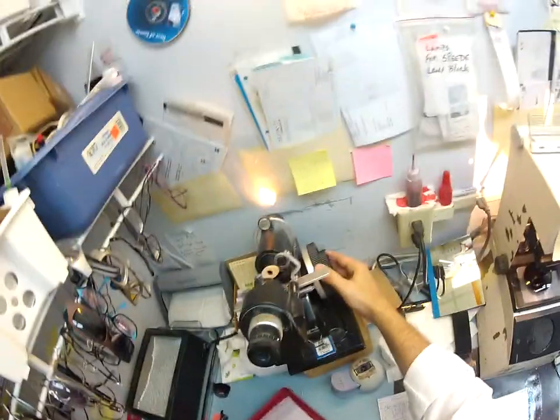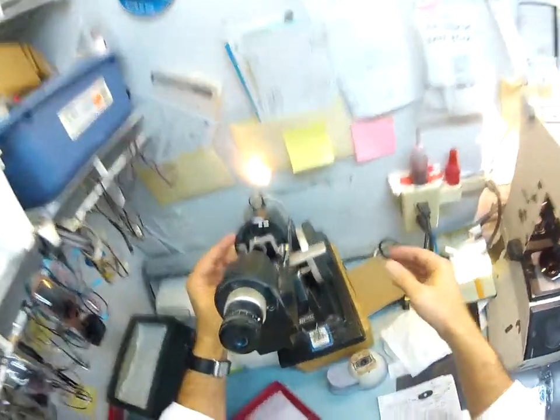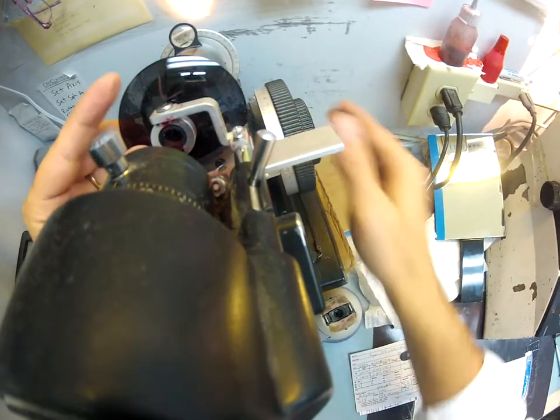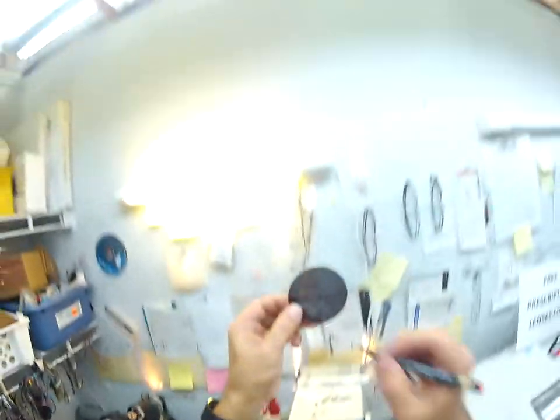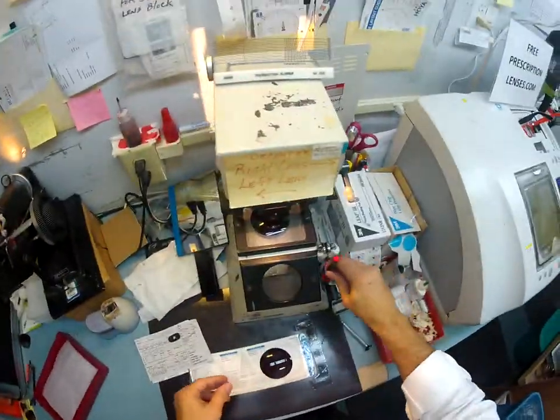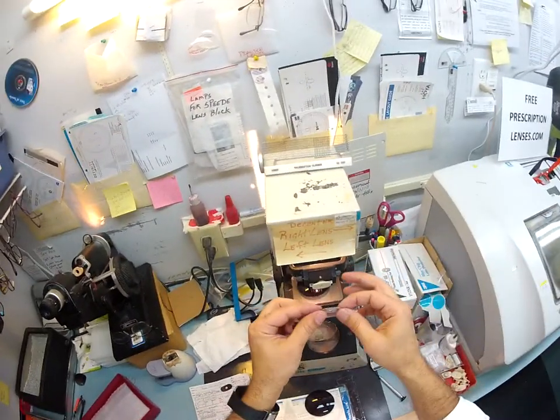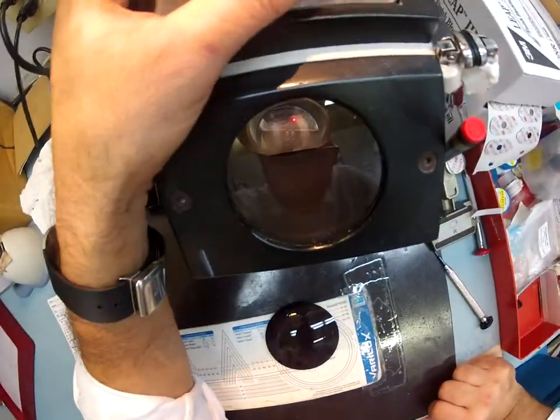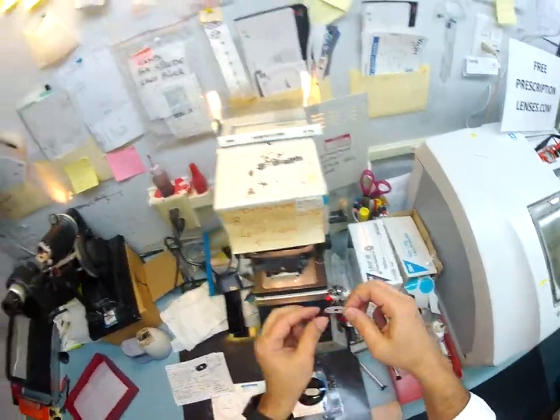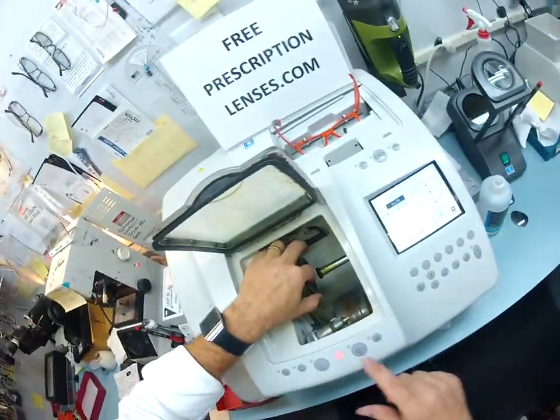Now let's do the same for the left lens. The axis for the left is 80, and we're still plus a quarter, minus 150. I'm going to spin this around until the sphere power comes in perfectly clear — it does. Get everything lined up perfectly, because with your astigmatism there's no margin of error. I'll put some dots on there, then place this block on here — this is what holds it in place while it's cutting. I'll put a little double-sided 3M sticky pad, line up your optical center to the crosshairs of my scope.